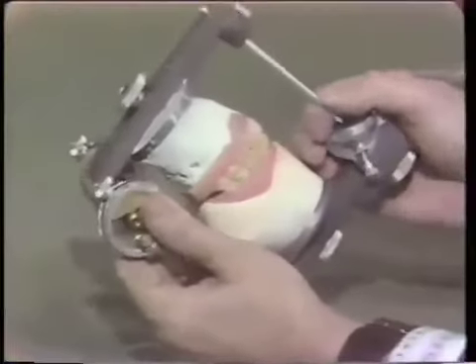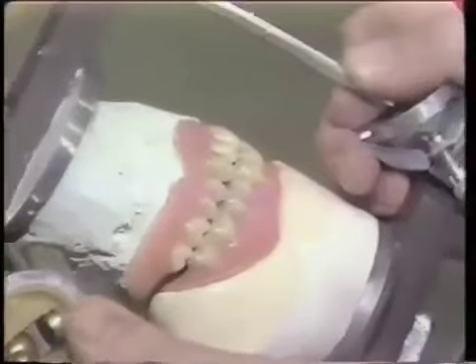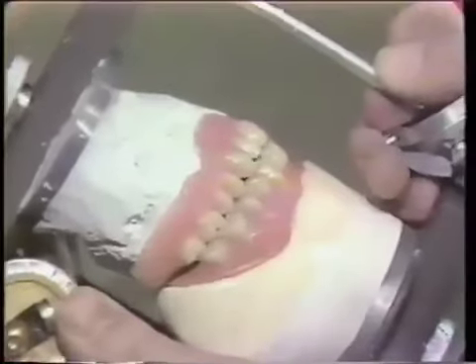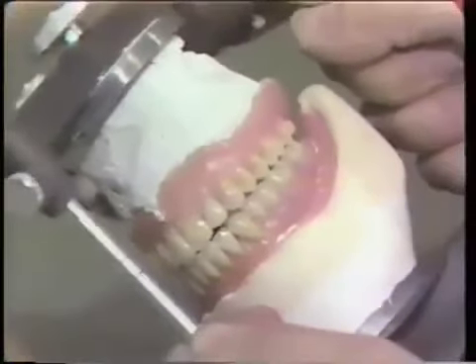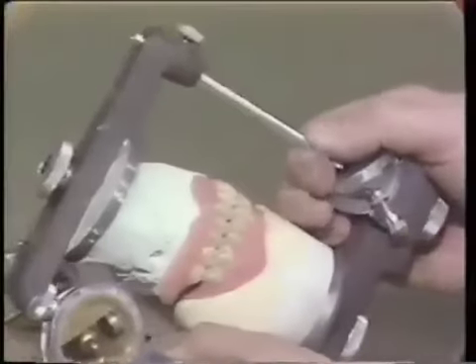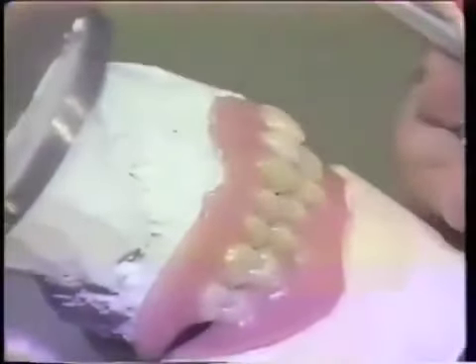Now we have adjusted the interferences that kept us from getting a good protrusive balance, and as I move the jaw forward I do indeed have anterior contact and at the same time good contact all the way along the occlusion. The denture is not locked in centric — when the patient goes forward he is not tripping on the anterior teeth and flipping the denture up in the posterior area. This gives the patient stability and, as far as the patient's tissues are concerned, this is in his favor.